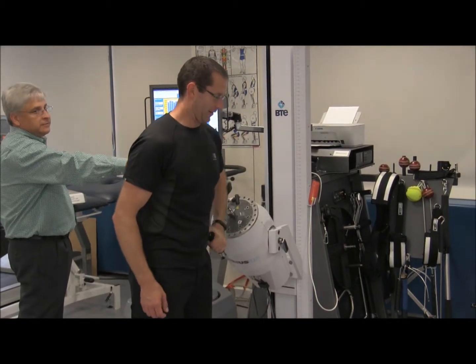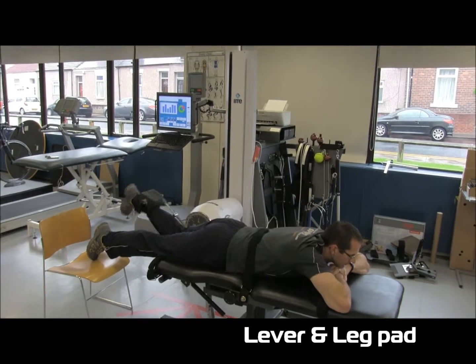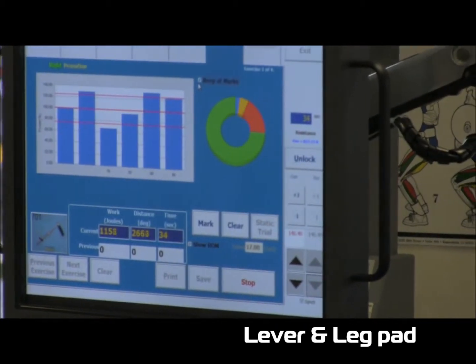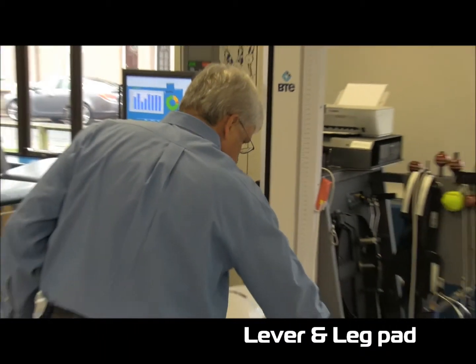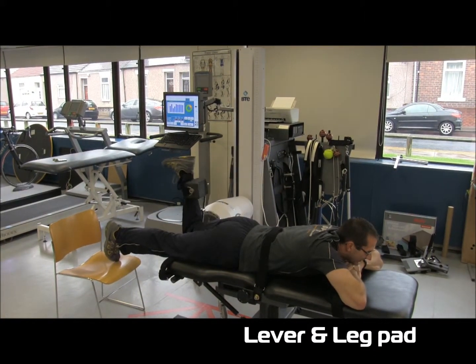How is his face doing? Stressful. How was it — eccentric — wasn't it eccentric when I was doing it?